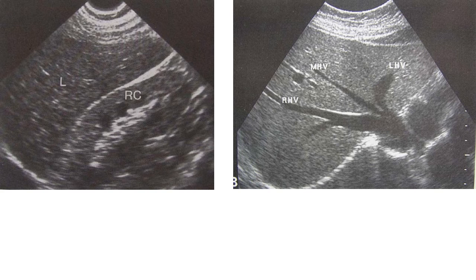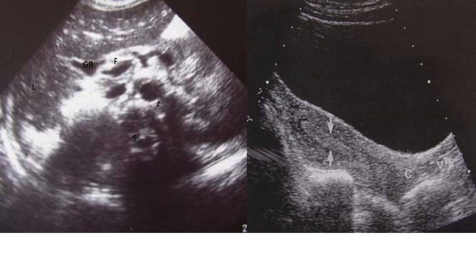Anechoic, and then you have the liver and the right kidney, which is isoechoic. Okay. So here you can see the uterus, and with the arrows, you can see the endometrium. So you can see the cervix and the vagina over there.